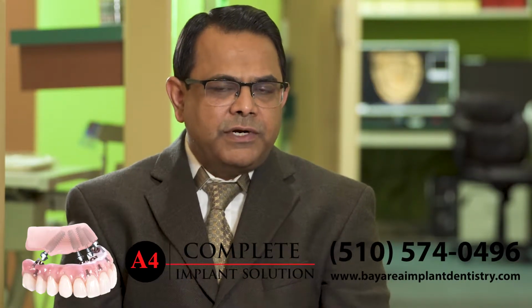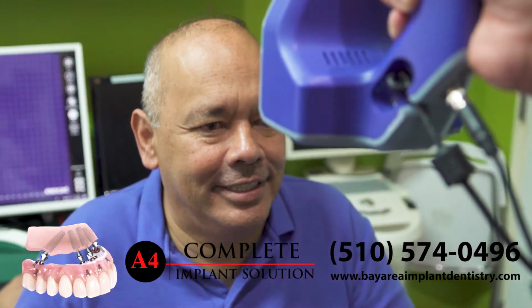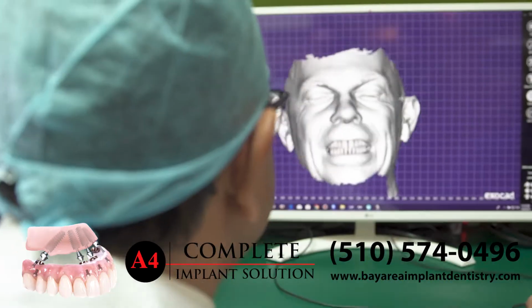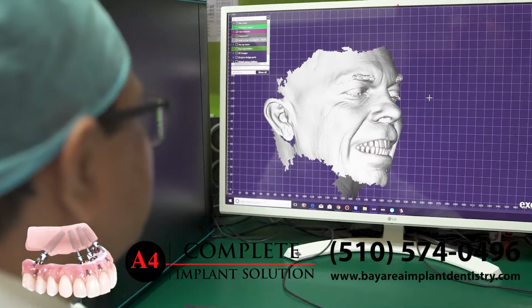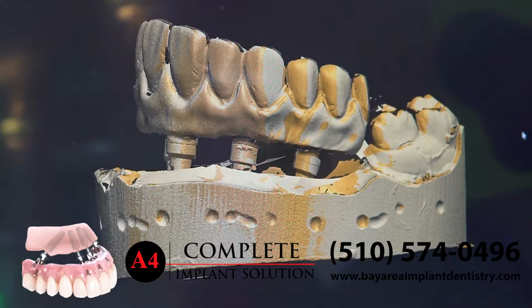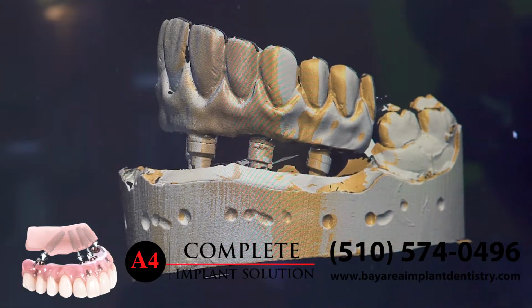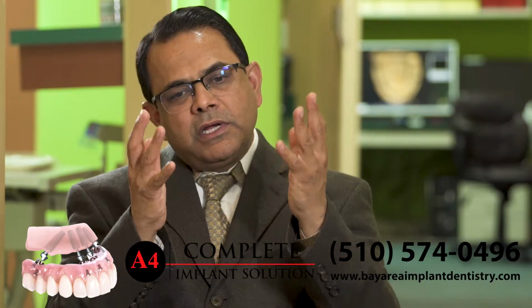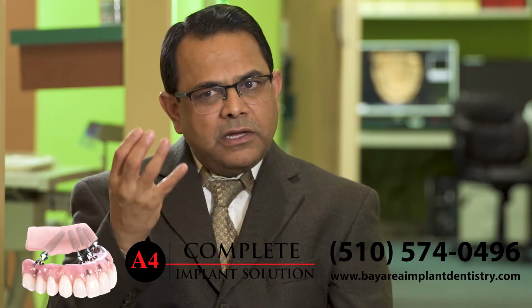On the designing software, then we combine with a face scan that we take. So the Trios will take the intraoral scan, and the face scan will take the outside facial scan, and we marry them together in the designing software, and we can make a smile that looks good in your face.